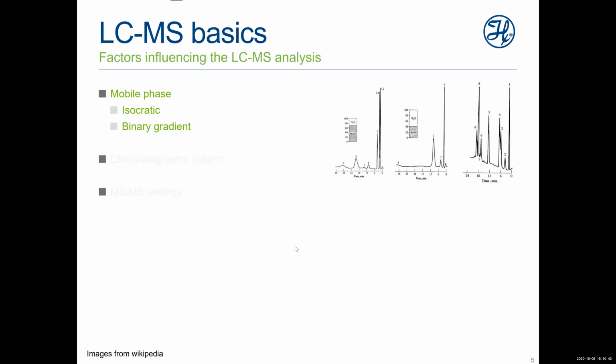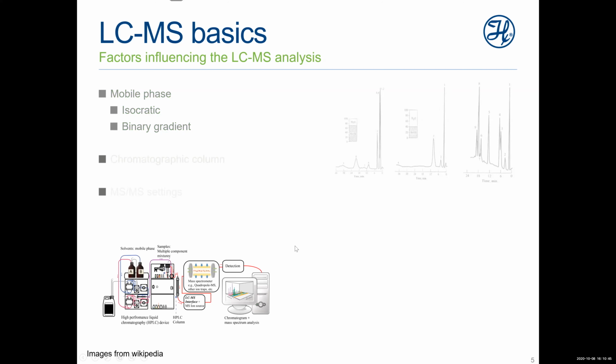Then we have to move to the chromatographic column, which is a part of the chromatographic system. And here in the picture below the text, you can see a simple scheme of a chromatographic system with the HPLC pump, the column, and the detector.